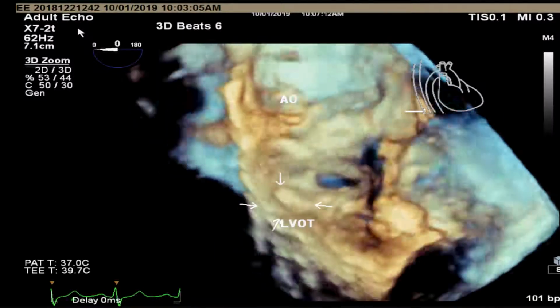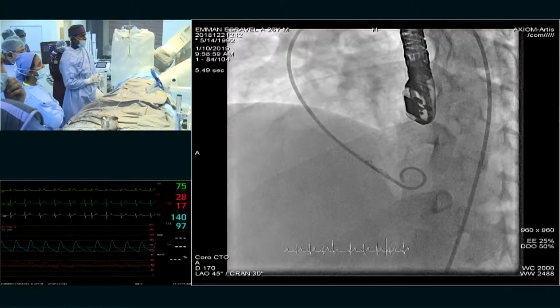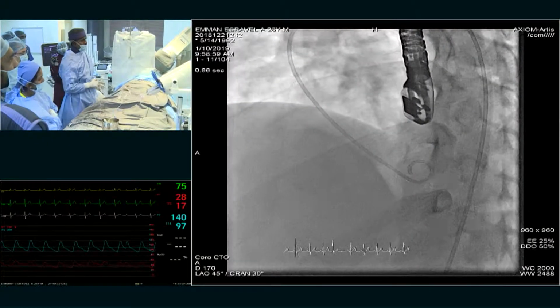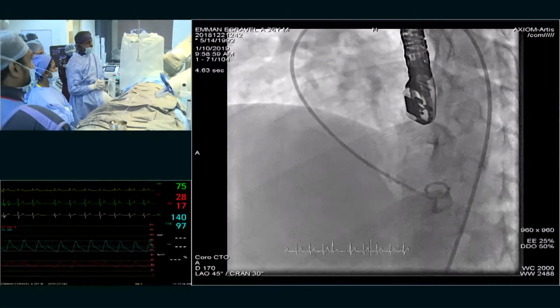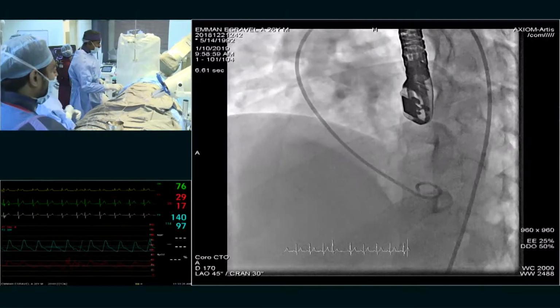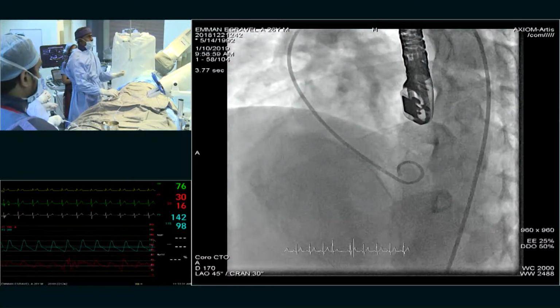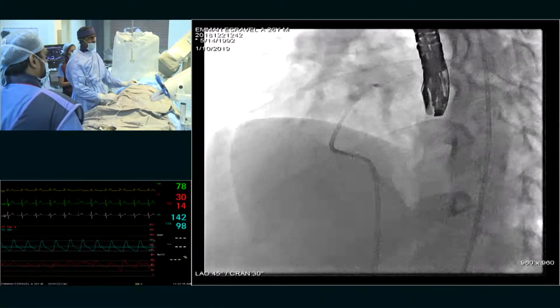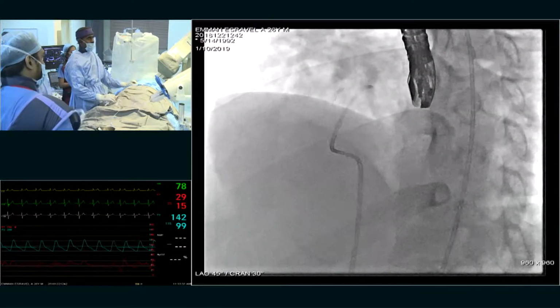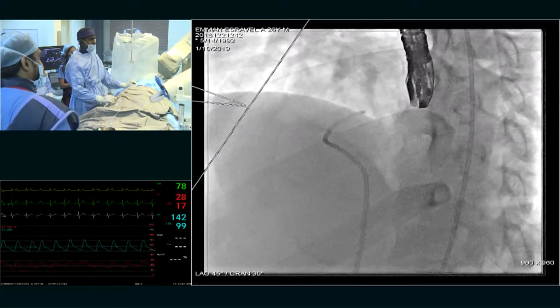So the hemodynamics are on live fluoro. The hemodynamics are normal, with normal pulmonary artery pressures. We did not do a QP/QS because of significant LV dilatation. Our plan is to directly cross the VSD antegrade from the right ventricular catheter. So what we do is we have an internal mammary artery catheter positioned in the pulmonary artery with pressure guidance, and we are slowly withdrawing the catheter.